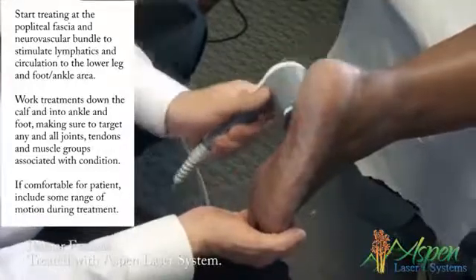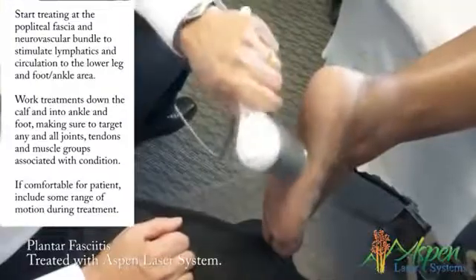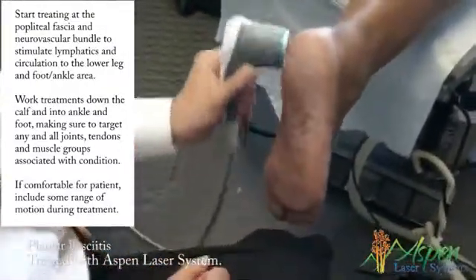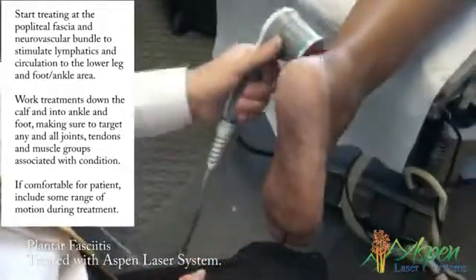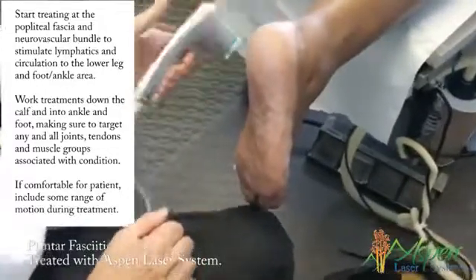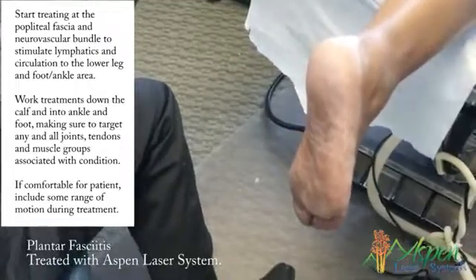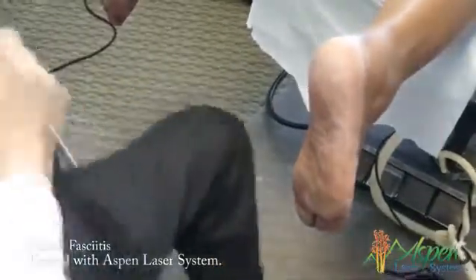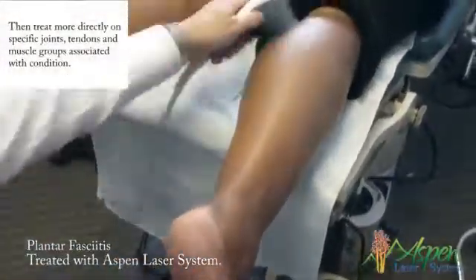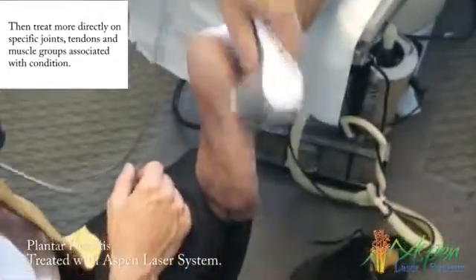I'll do the posterior tibial. I'm going to shut it off for a minute — I want to move up and put it to 20. Usually it should be very relaxing. I'll do the peroneal longus and brevis, come around here.